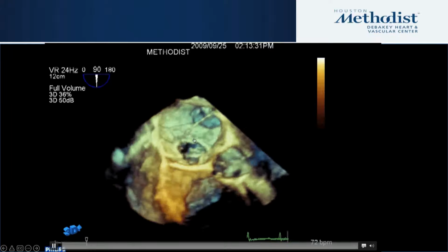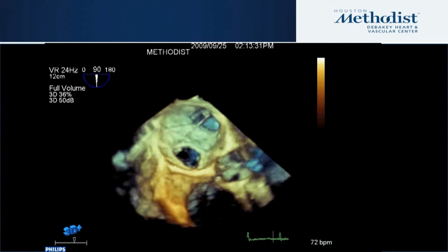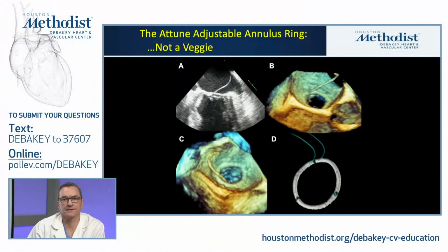You see a surgical mitral ring, a long linear mass that's very unlike any sort of classic endocarditis lesion. And this is where history in the patient, and particularly the surgical history, is exceedingly important. And in fact, this was not vegetation at all. This was an untied suture from this particular surgical device called an Attune ring, which is used to perform an undersized annuloplasty. So the suture had been untied, left wiggling in the left atrium, and trying to confuse echocardiographers ever since. Unsuccessfully. So that's an example of knowing the history of the patient and the intervention before coming up with the diagnosis of an atypical endocarditis.